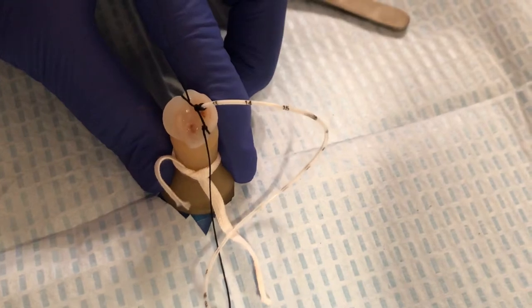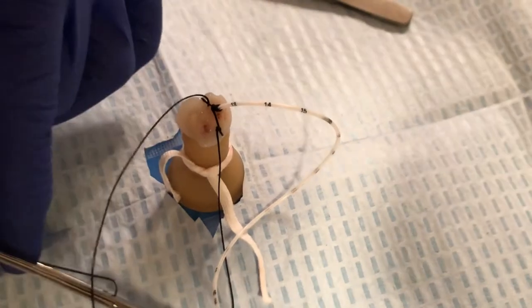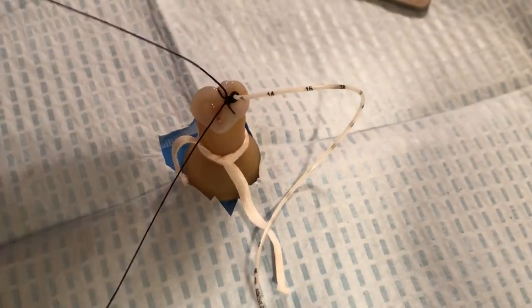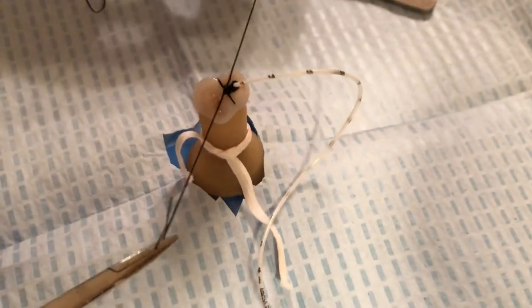We are going to do exactly what we started with, which are two simple flat instrument knots — there's one and two.